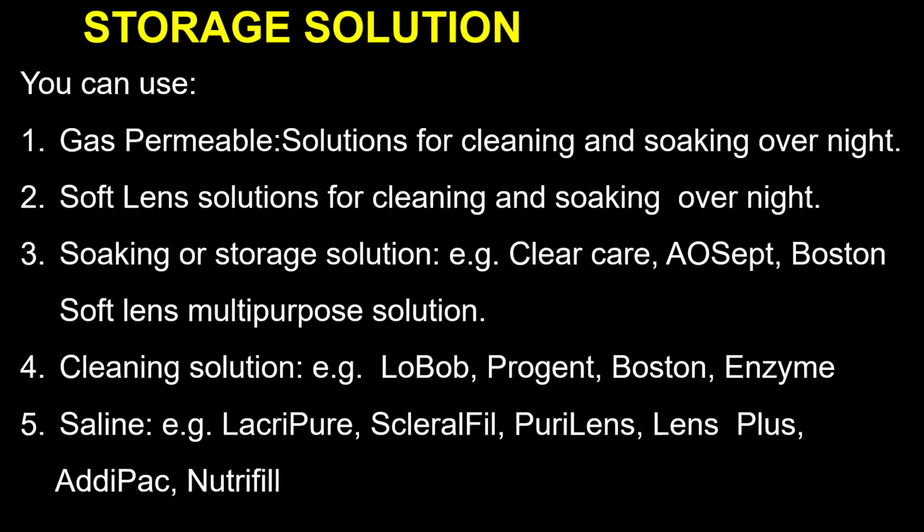the pterygium is very, very bad, the patient will struggle. You struggle to achieve stability of the fitting. So that's the major challenge. It's not like you can't fit it, but achieving stability is the problem. So most times, I think here in the UK, usually they have to take pictures. Of course, pterygium is not common here because of the environmental factors, but that's necessary to take pictures so the manufacturer can look at the factor in the production.